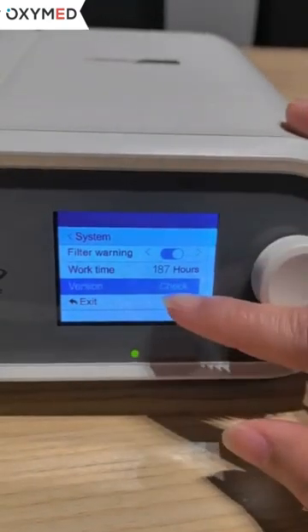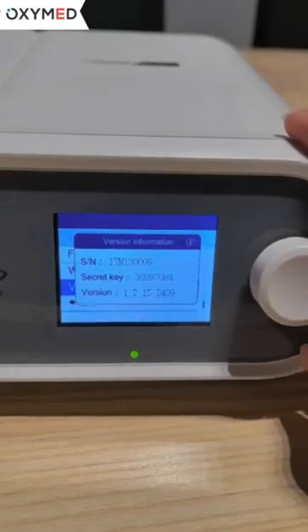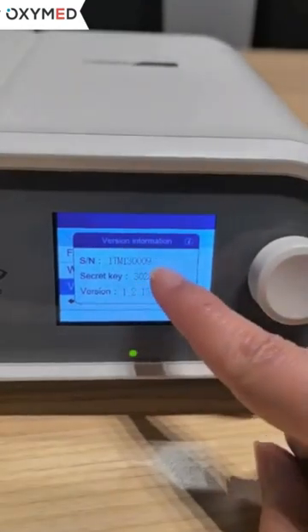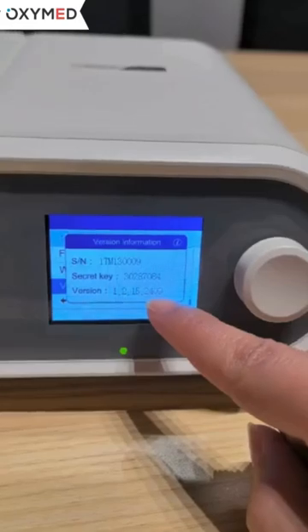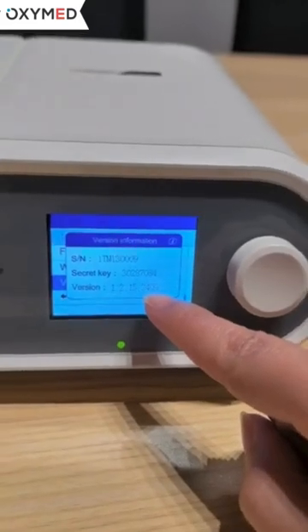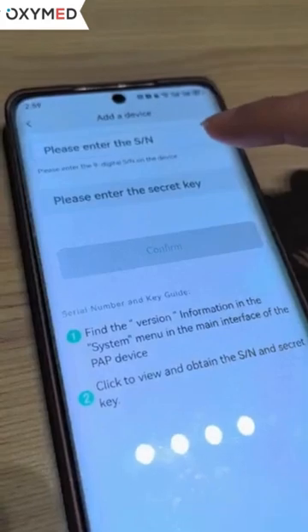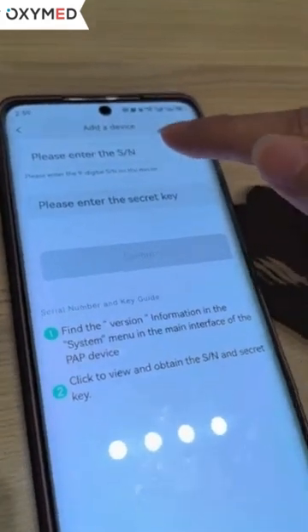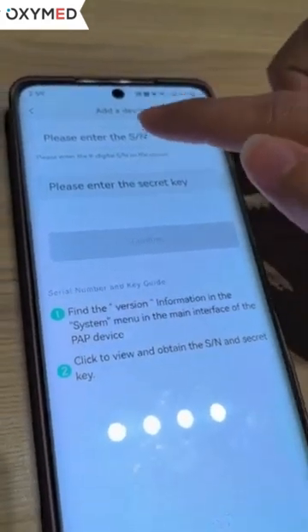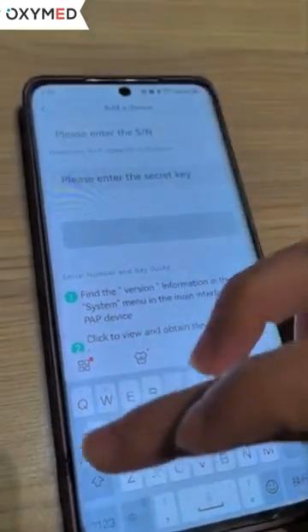Next, we rotate the control button cursor to 'Version Check' and press it. We will then see the device number, secret key, and the version of the device.